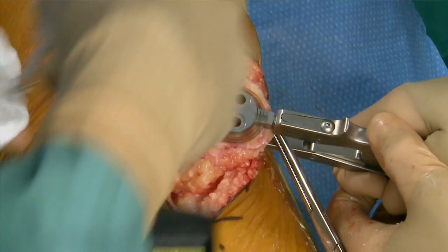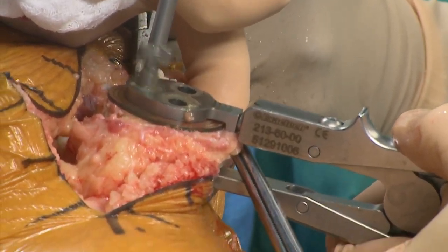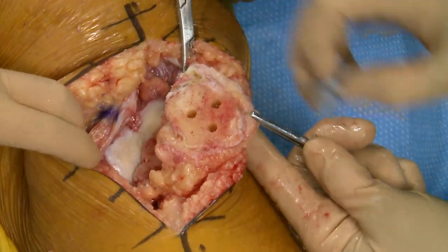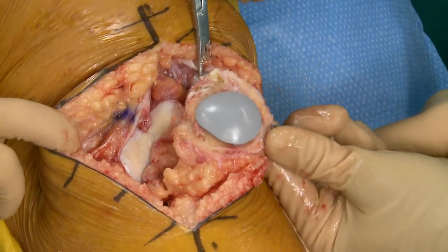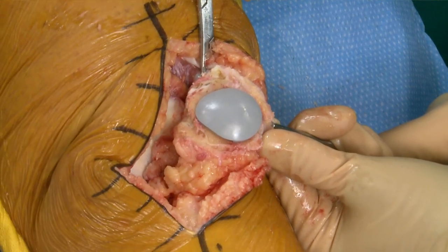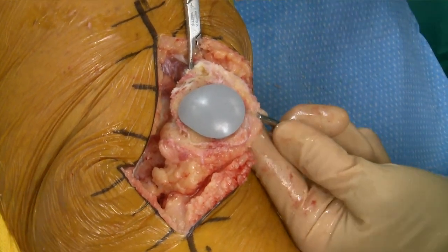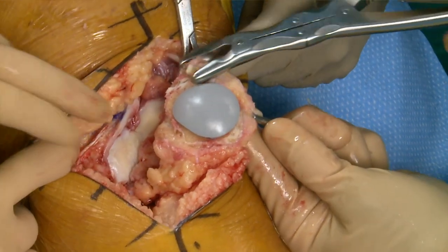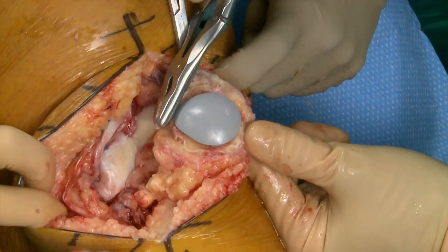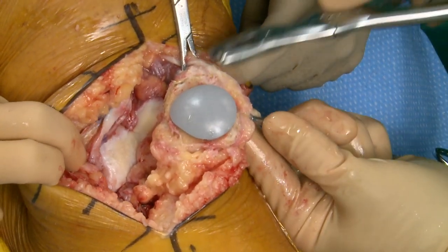All the sizes use the same drill hole. This is a 32, and that's an asymmetric button. I try to get it as far medial and proximal as I can, and this avocado design gives good coverage. If I have much uncovered bone on this side I will remove it — with a round patella I find myself doing that a little more often, and with this design less often.